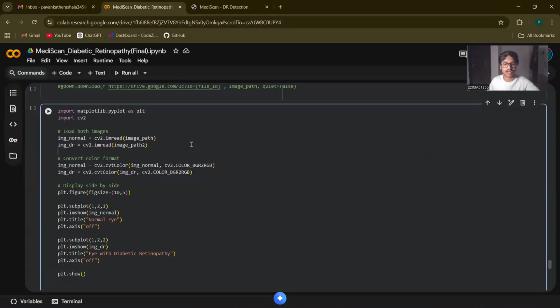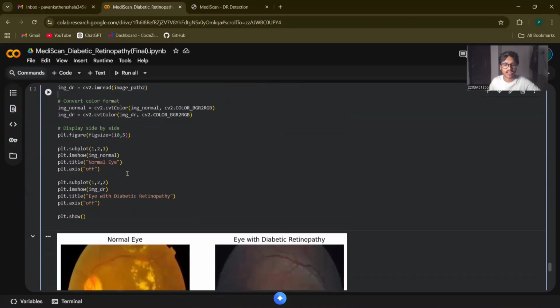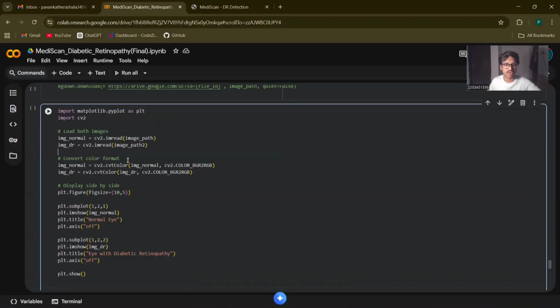So this segment uses OpenCV, cv2, and Matplotlib to prepare and display our retinal images in a clear way. We imported the cv2 library, which is essential for computer vision tasks, and cv2.imread. This function reads the image files from the paths defined earlier and converts them into numerical arrays, like matrices that Python can process. And next, we use color correction.